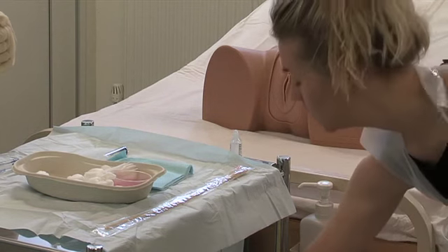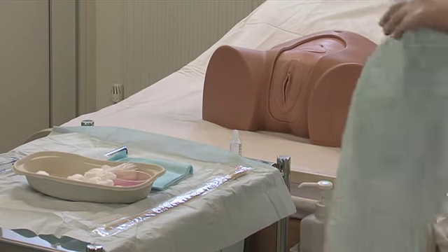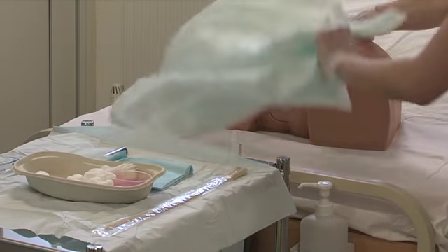The patient should be positioned supine with knees bent, hips flexed, and feet resting about 60 centimeters apart. There is no need to fully expose the patient at this stage. Place a disposable incontinence pad under the patient's thighs.